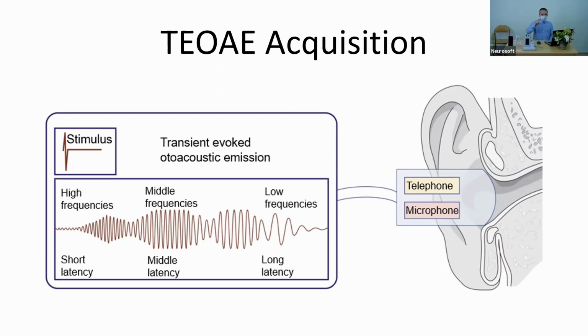One stimulus is large with a positive polarity, and then there are 3 smaller stimuli with negative polarity. This is done to compensate for the non-linearities inside the cochlea and hair cell mechanism.